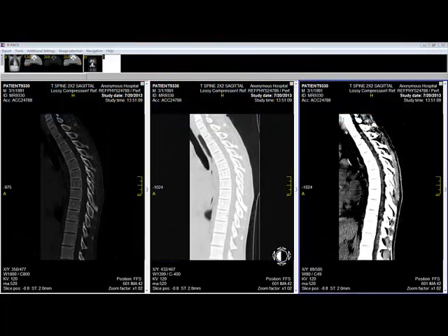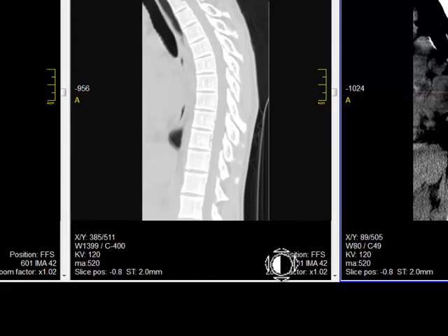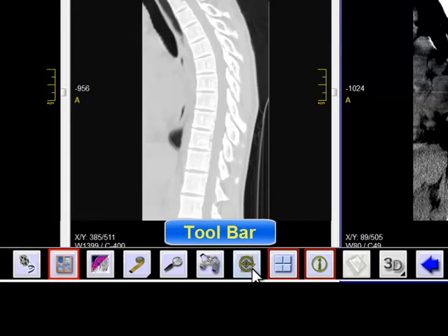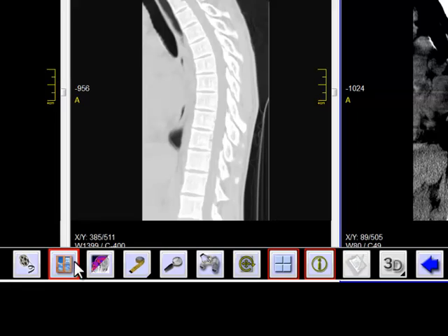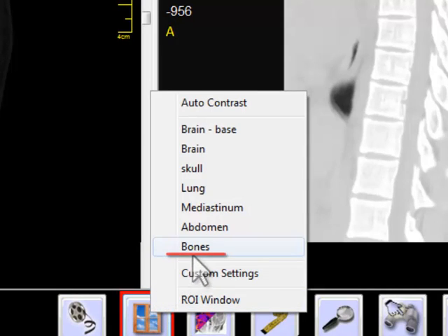There are three steps in selecting the preset windowing levels. First, you move your cursor to the bottom of the screen to activate the toolbar. Second, you click on the windowing icon — you right click. Third, you set the preset windowing level that you would like to view. So we will preset bones.